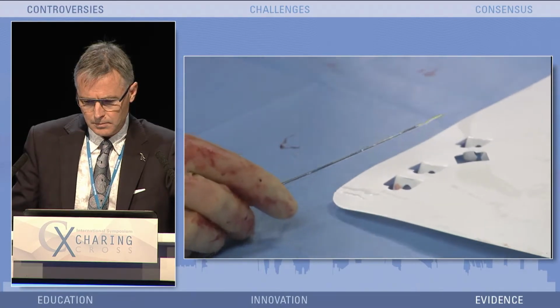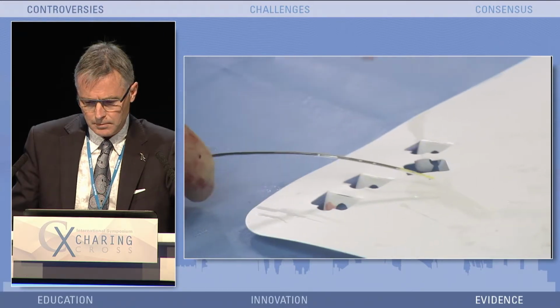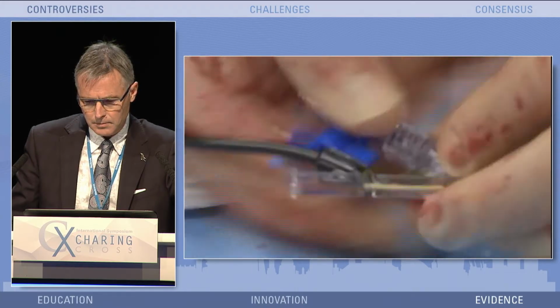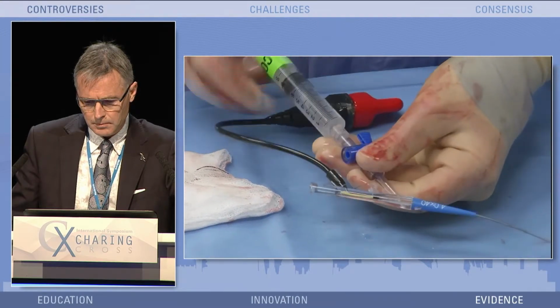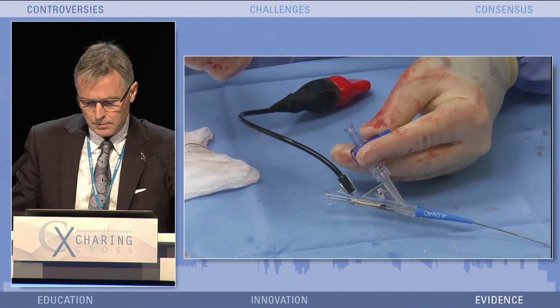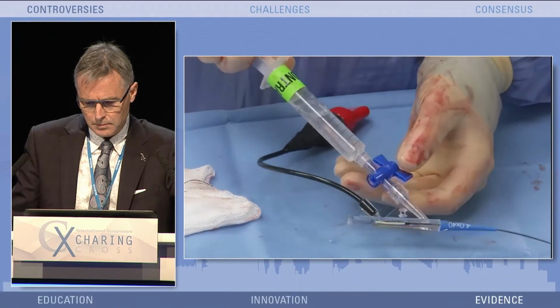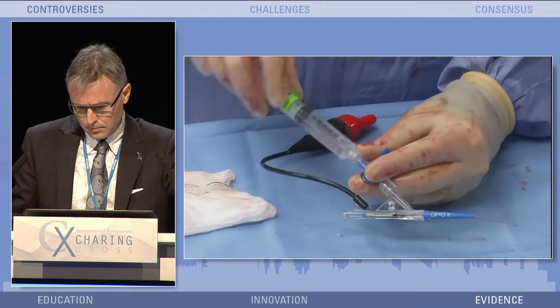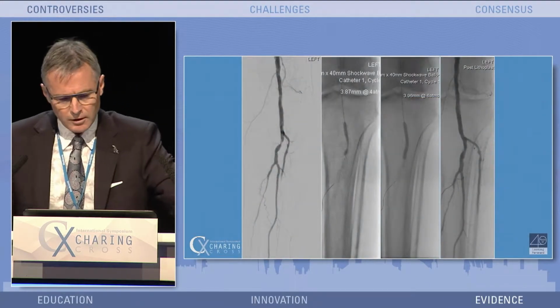We'll just flush the tip through the guide wire lumen, and then in the same way as the femoropopliteal device, we need to once again deaerate the balloon so that we maximize fluid wall contact during lithotripsy, and so we just do that by aspirating. Actually, in our limited experience with this catheter, it's considerably easier to deaerate than the femoropopliteal device. So to keep things moving, I think we'll leave that there.